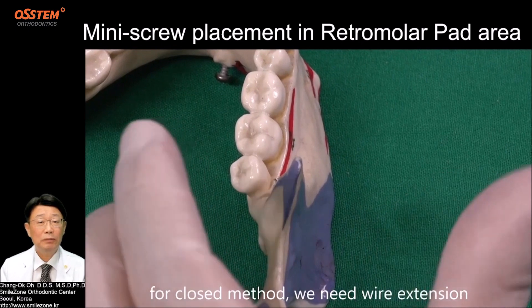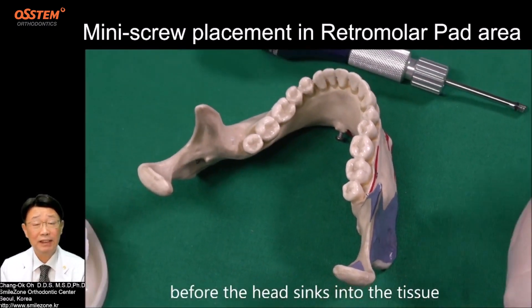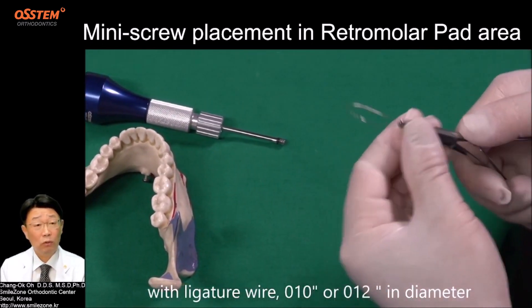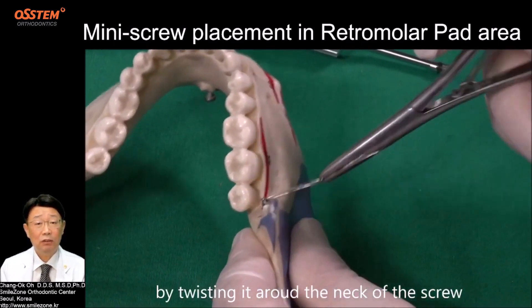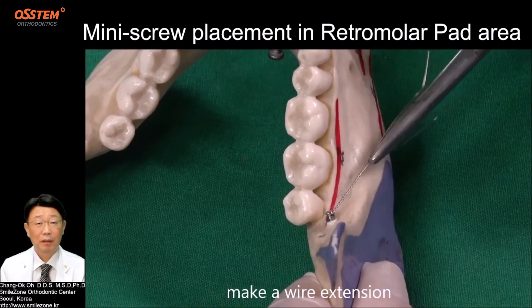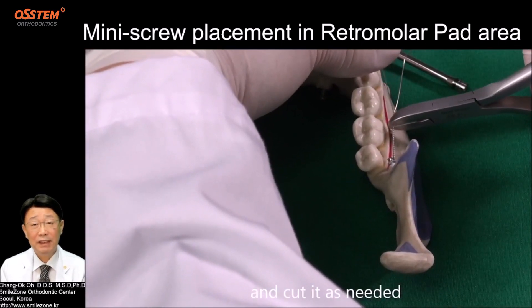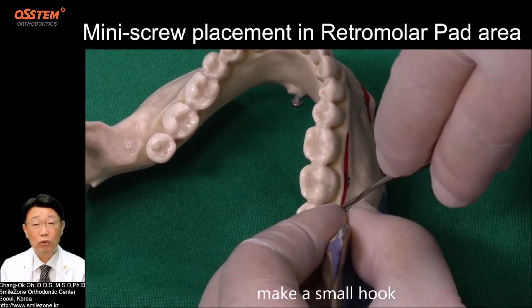For the closed method, we need a wire extension. Before the head sinks into the tissue, with a ligature wire — 0.010 or 0.012 in diameter — by twisting it around the neck of the screw, make a wire extension, and cut it as needed. Then make a small hook.